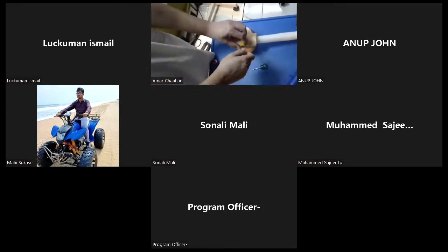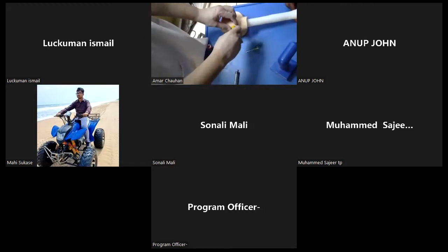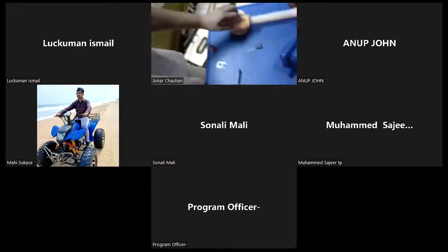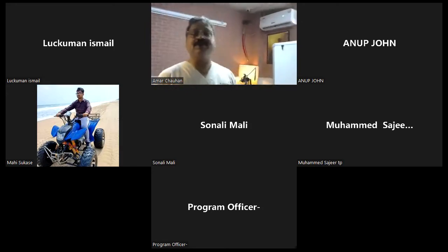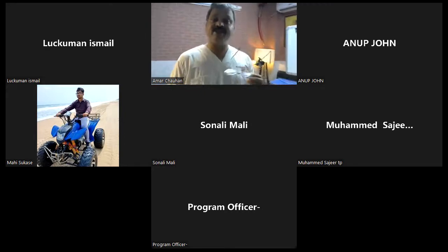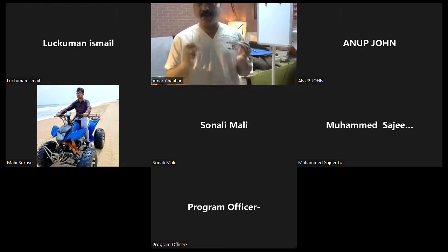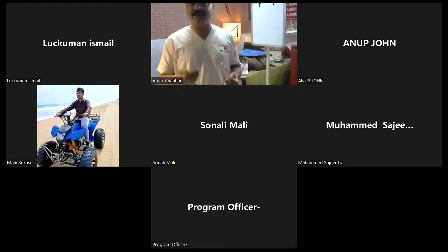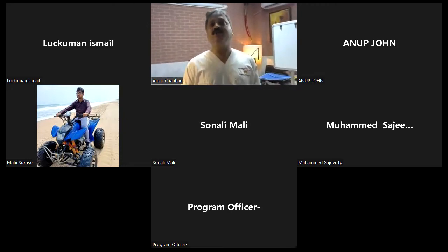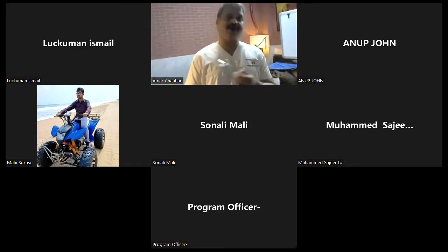Nobody has a humerus IO access mannequin in the world. We are the only one. We have designed and manufactured this humerus IO access mannequin also. In adults, when you need rapid infusion, in the humerus the infusion rate is up to 13 liters per hour, whereas in the tibia it is only 6 liters. In the femur, it is 8 liters, distal femur. But in the proximal humerus, it is 13 liters. So when you need rapid infusion, you have to do a humerus IO access. And you can do more than one IO access also. Like if the patient is very sick, one you can do in the tibia, second you can do in the humerus.